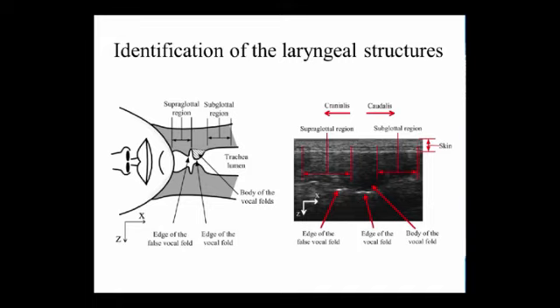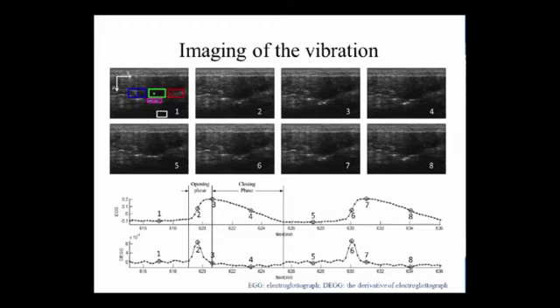Here is the frame series we got, and these 8 frames of ultrasound images are captured at four different phases across two vibration cycles.